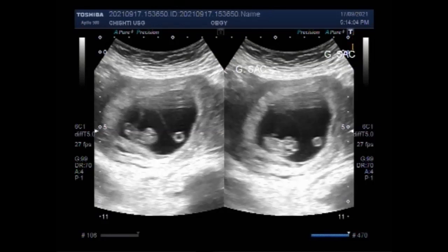The fetal pole is usually identified at 6.5 weeks with transabdominal ultrasound imaging and at 6 weeks with transvaginal ultrasound imaging, although it may not be seen until 9 weeks in some cases. When the fetal pole measures 7 millimeter or more, a fetal heartbeat should be detected.